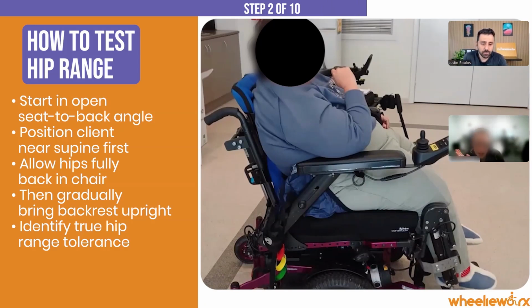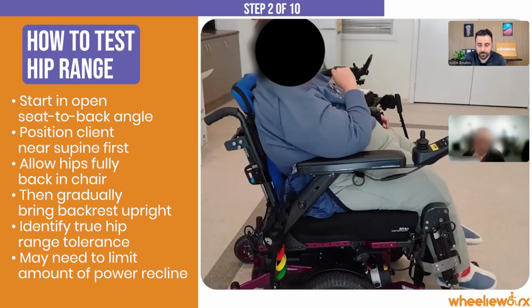Potentially, I want to come further forward. You could limit it so it didn't come forward anymore if it was programmed. You could do a non-power reclining backrest. If she's got MS, she's progressive, I'm sure we're probably going to want power recline. If she's bariatric, she's got limited hip mobility. So you're probably going to want to go power recline anyway, but you can limit it as you said.